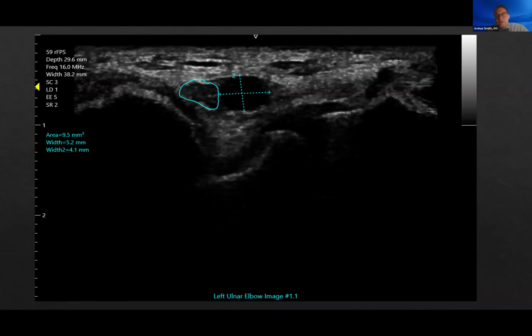But if you just did the nerve conduction study and got down and said it's the elbow, and even if you did inching, you'd think it really looks like it's around the medial epicondyle. Maybe that patient does go and get a transposition done. This patient had a transposition, which must not have worked well because the nerve is not where it should be for a transposition. Maybe it migrated back and there was scar tissue. But that doesn't do anything about the cystic structure here.